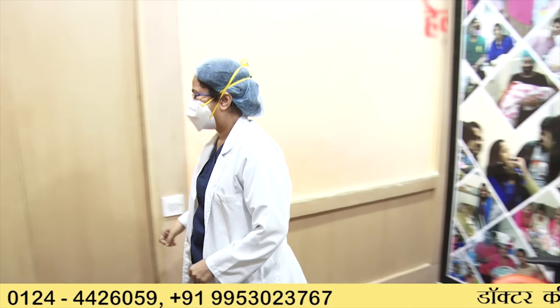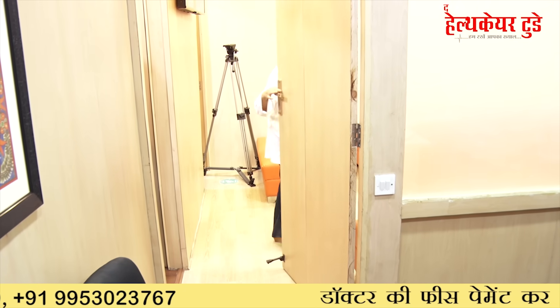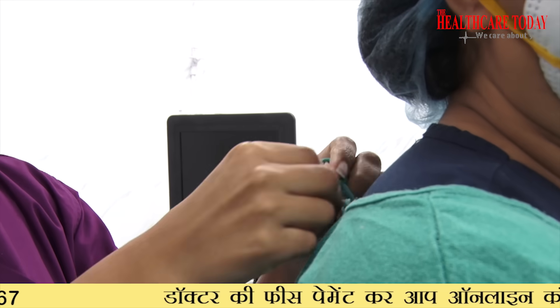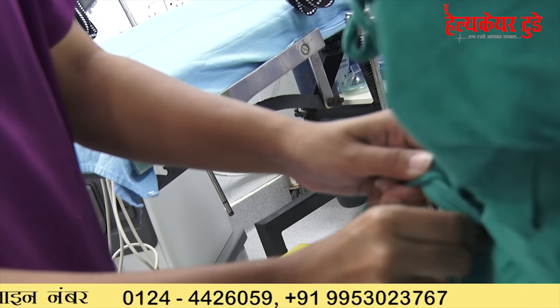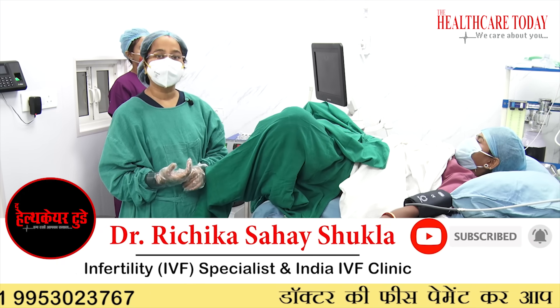The working is ready for the procedure. Today we will talk about ovum pick-up — we will get a little knowledge about the ovum pick-up.